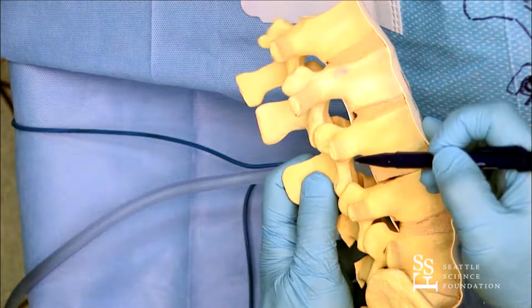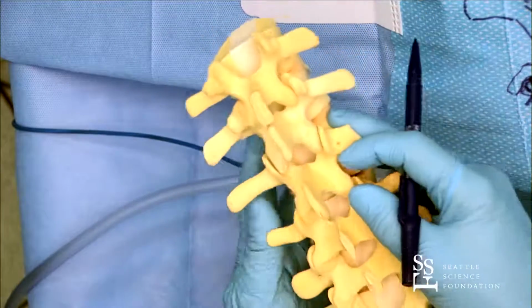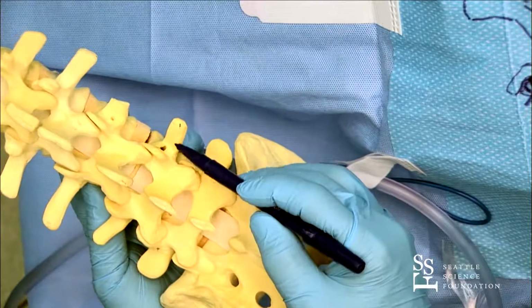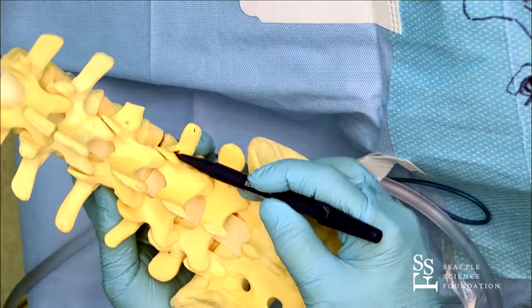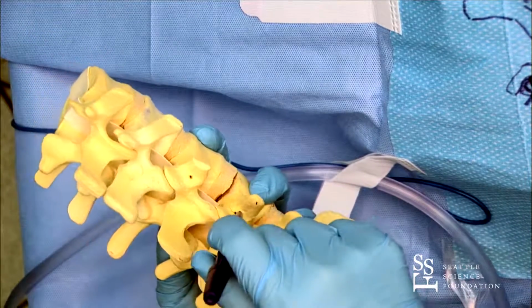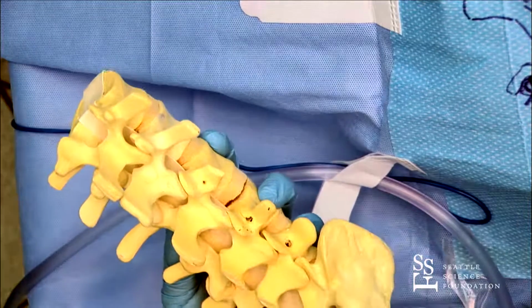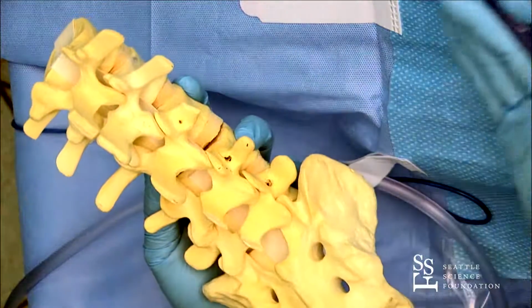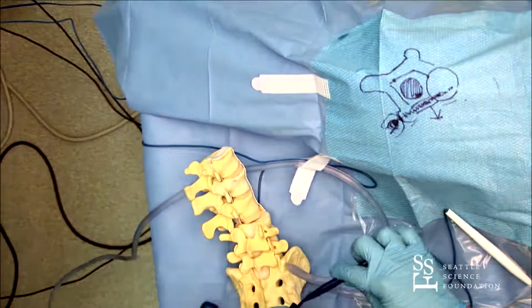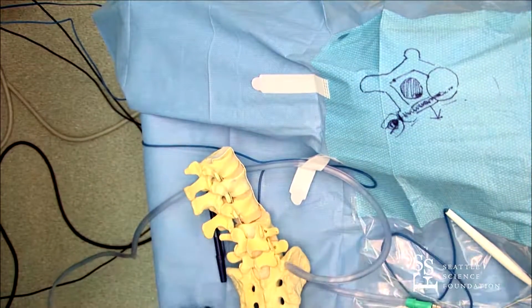And we're gonna do this with image guidance. Typically, the way we did it was we would open up the spine, dissect all the muscles, and then look at the junction of the transverse process as it meets what we call the facet joint, and that would be the landmark of where we would put the screw into the vertebral body. But we'd have to really dissect the whole musculature off. So we're gonna do this with image aided guidance, and this is a fluoroscopy unit. It basically just takes x-ray shots.